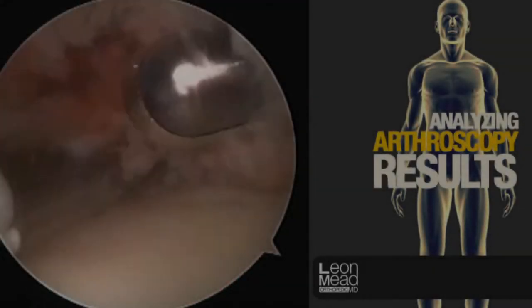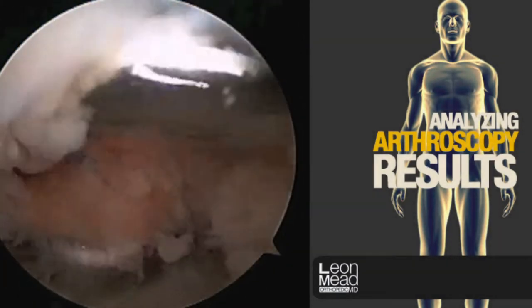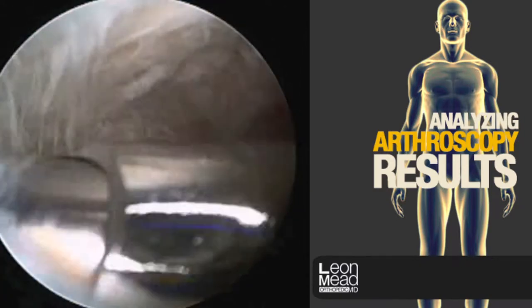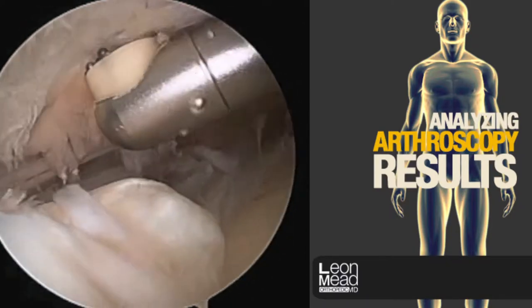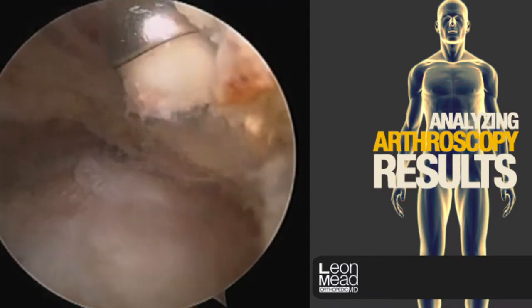We put an arthroscope in the area where the rotator cuff runs, called the subacromial space. We were removing the inflammatory tissue as well as the degenerative tissue, evidenced by the large amount of fraying. All of this tissue is abnormal. We've used an electrocautery device to also assist us in the removal of this abnormal tissue.